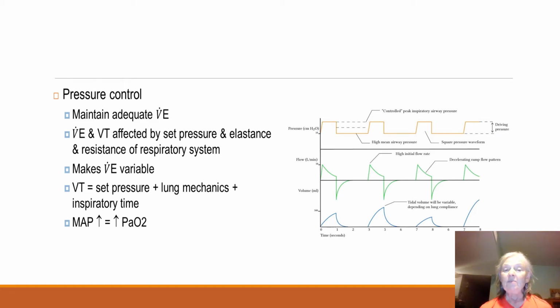We sometimes have a variable minute ventilation. Same reason why. The tidal volume is going to be your set pressure, your lung mechanics, inspiratory time, and your MAP increases, and then because it increases, we increase that PaO2.